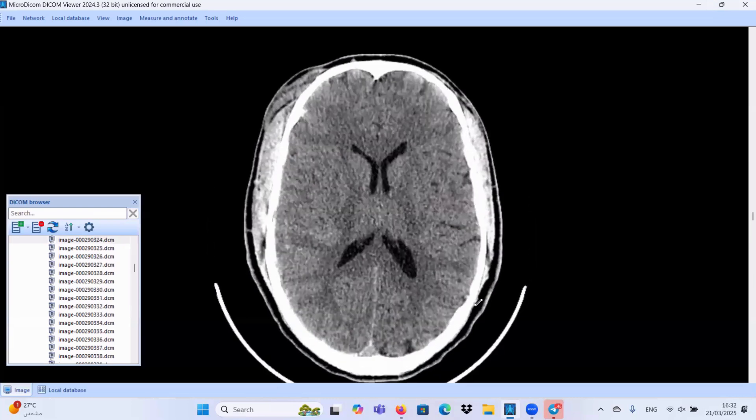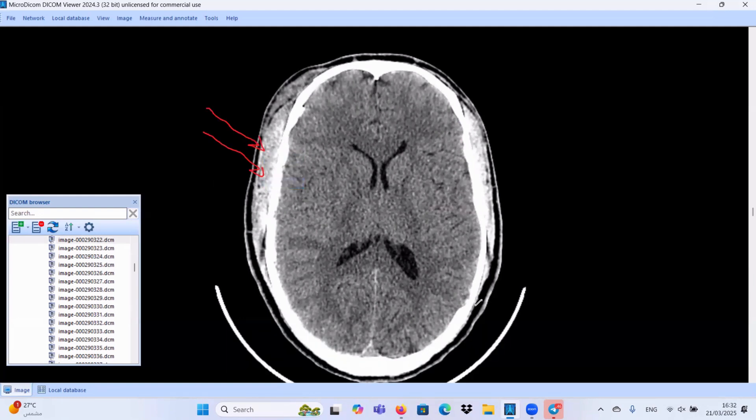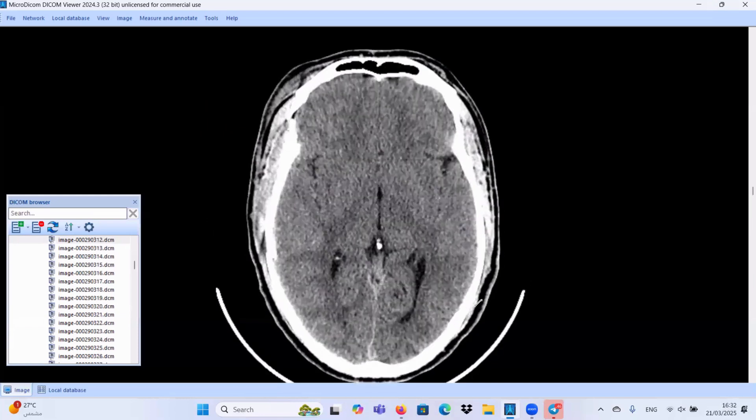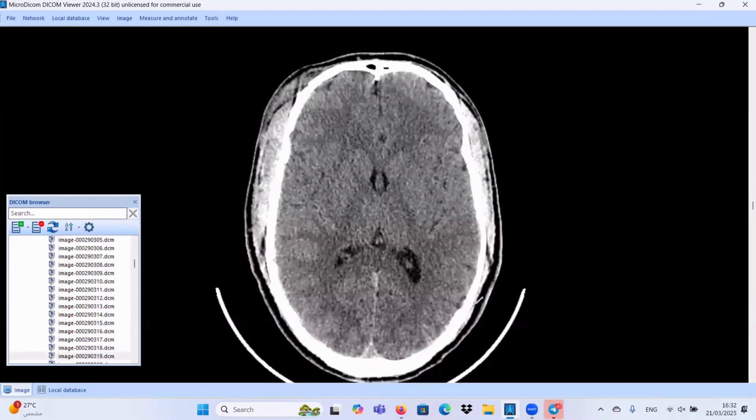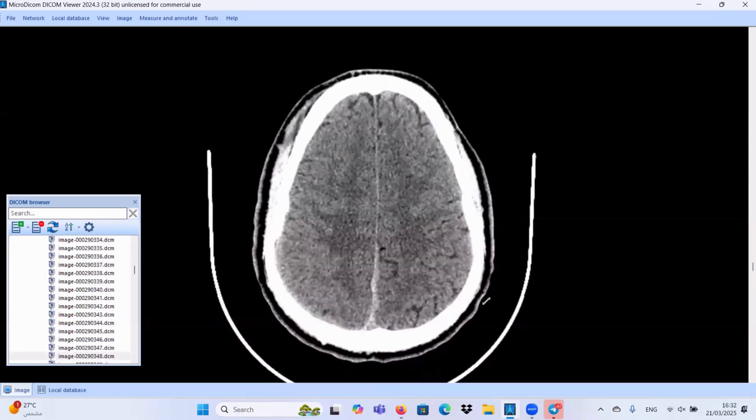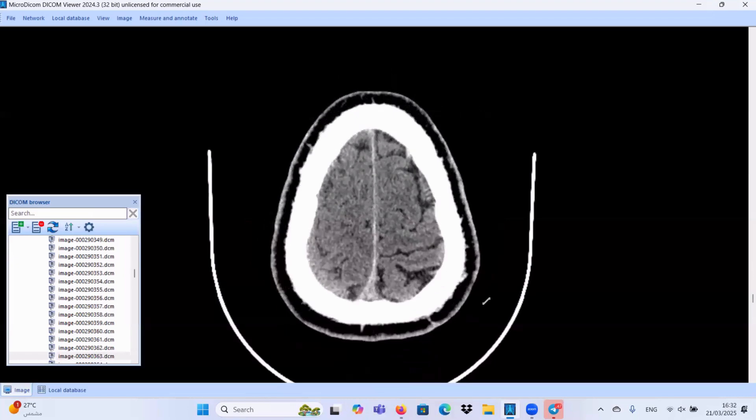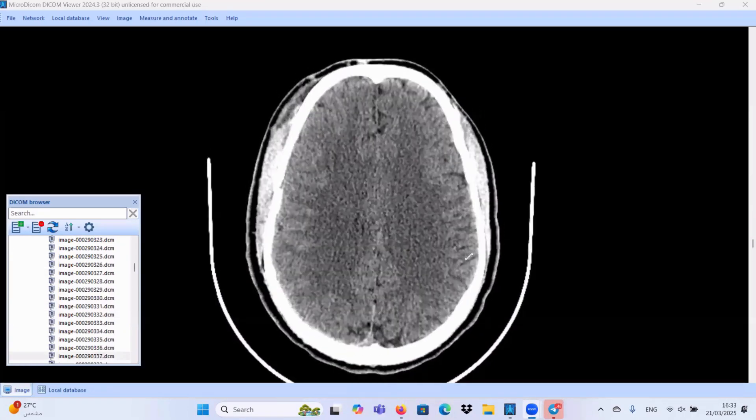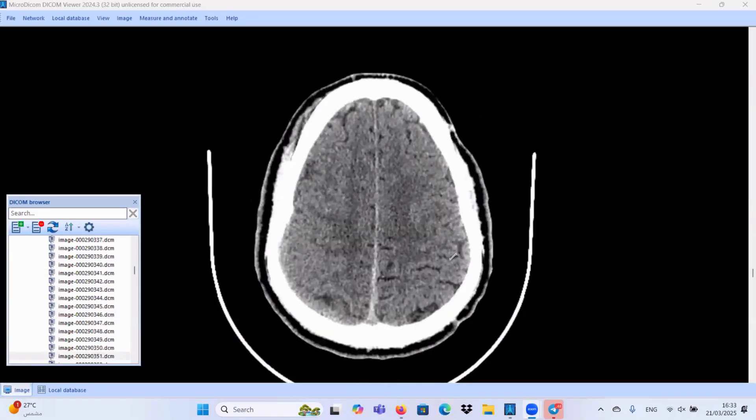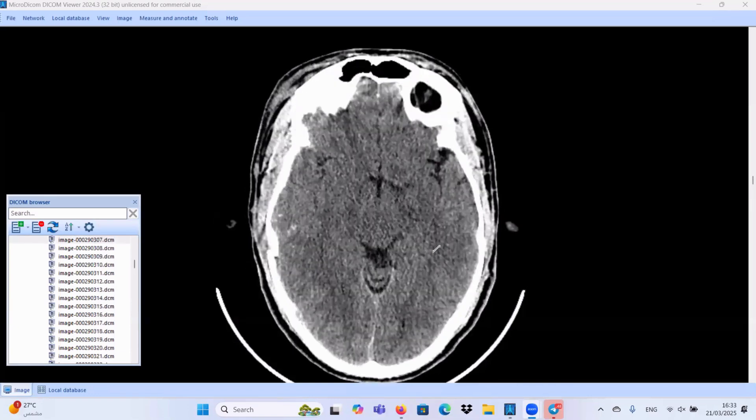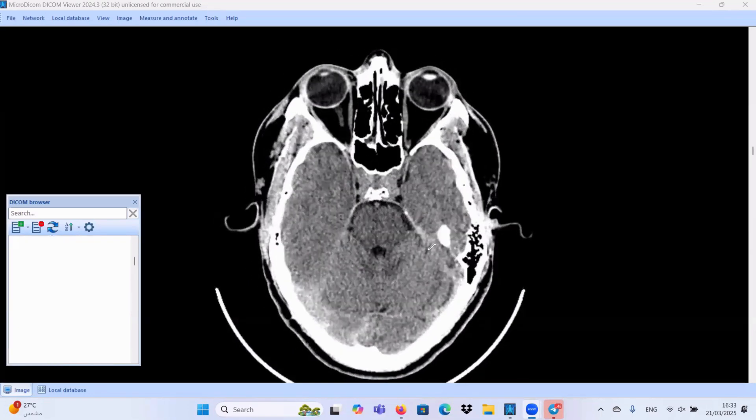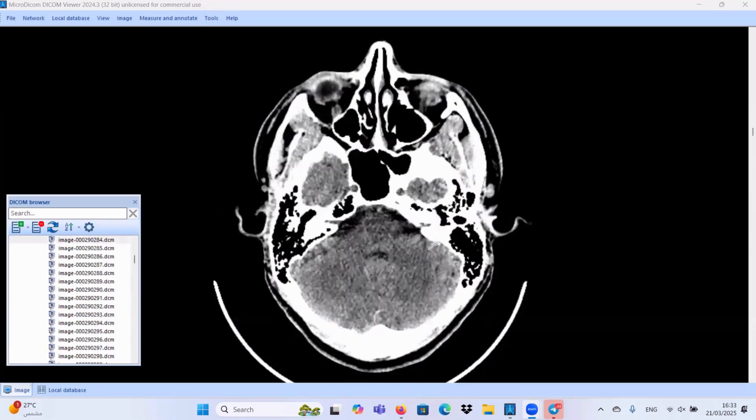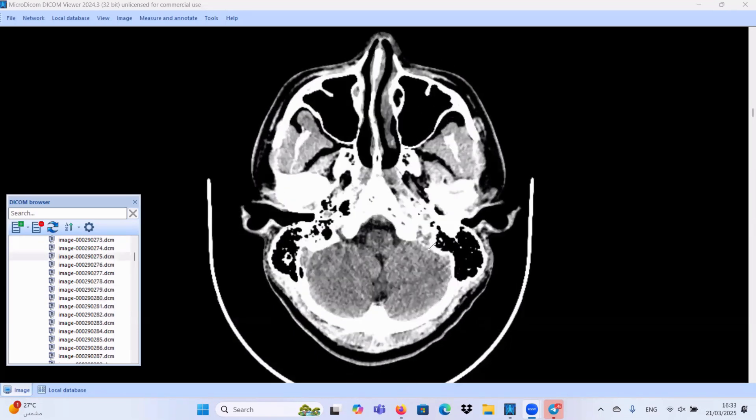Once we have any trauma case, as we said, this is the direction of the trauma. So, we should check if there is any contrecoup injury of the brain. We don't have any contrecoup injury. We don't have any cerebral contusions on the contralateral side. We don't have any intraventricular hemorrhage, no subarachnoid hemorrhage. Posterior fossa structures are clear.